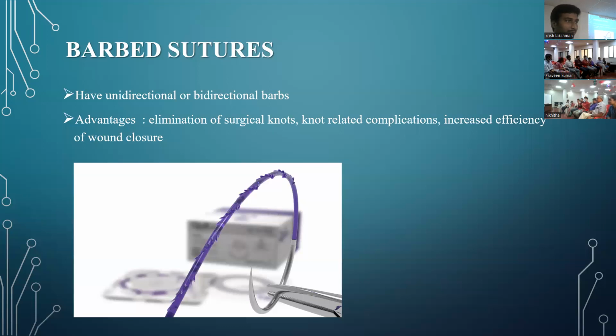You put a loop there. So for bowel anastomosis in laparoscopy, you don't have to put a knot at the end. Do the same thing two or three times in the same area, like we're locking it in. You go beyond the edge of the anastomosis and take two or three passes, so that it doesn't retract back. So, should it have a good memory?